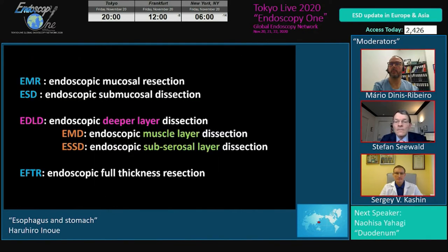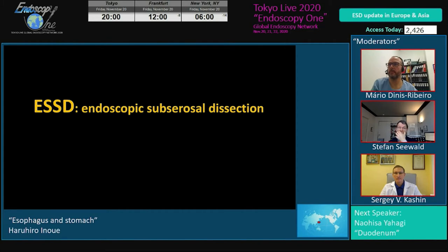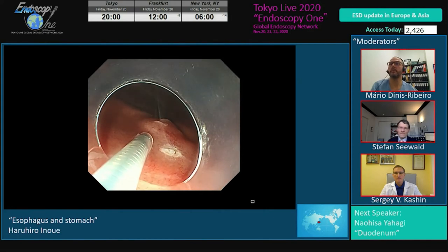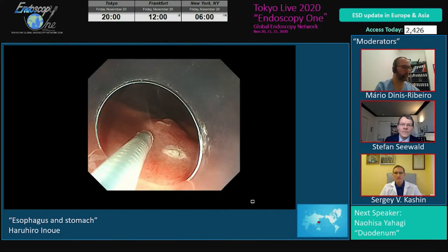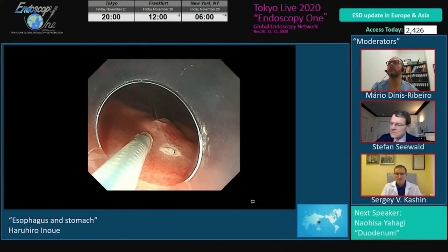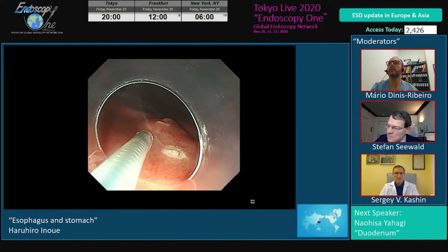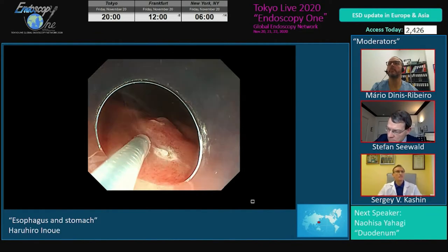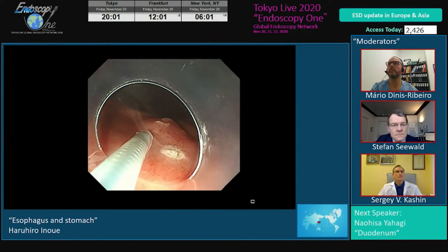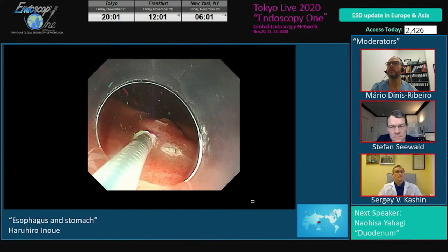So next, I would like to demonstrate a case of endoscopic subserosal dissection. This was first reported by a Nanjing doctor. FNA demonstrated this tumor is a GIST. The tumor size is very small, less than around 1 centimeter, but we have to take out this tumor.